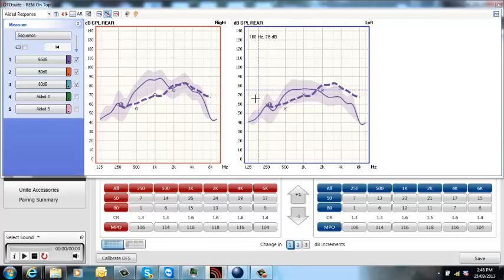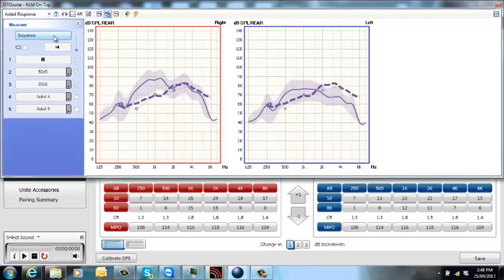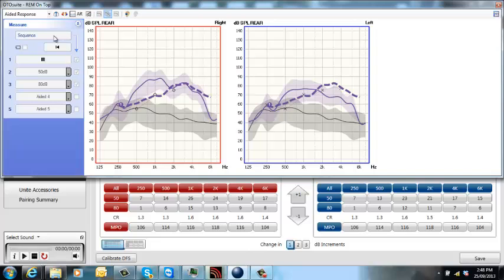I like to use this view with the sequence, so I'll tick 65, 50, and 80, and press the sequence button and it will run all three signals for me. So let's have a look at what that looks like.